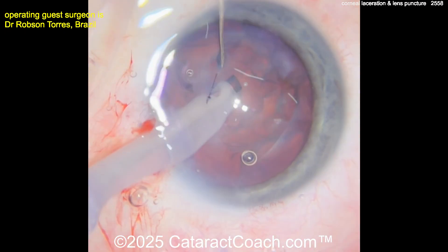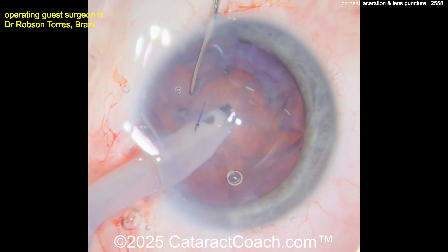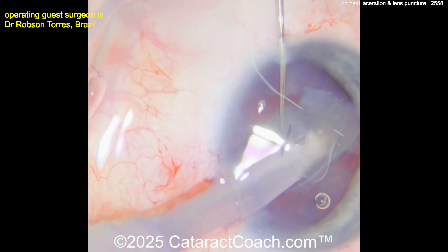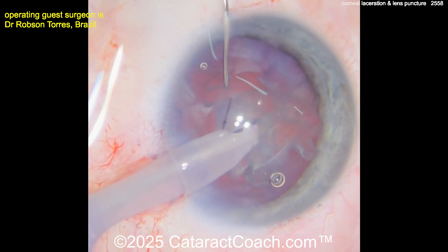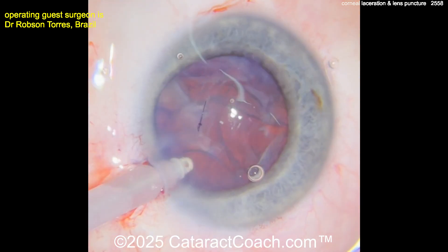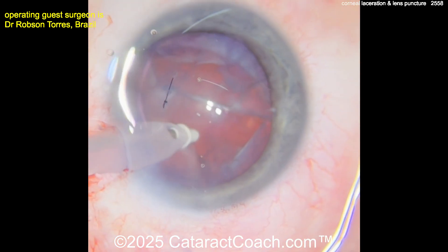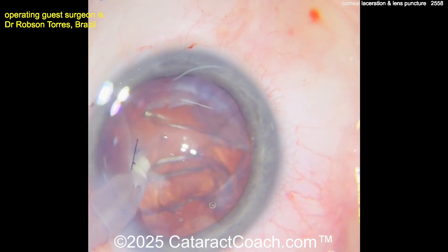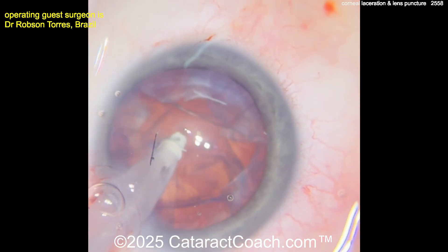Now putting the phaco probe in, you're going to aspirate this easily — again this is butter soft, you could just use the IA probe. You need to emphasize to this patient that they've got to wear safety glasses. When I do any work around my house I am so cautious about wearing them — we've seen all these cases in our own clinics. With the IA probe going inside the eye, remove all the cortex from the strong areas first, then go near the weak area towards the end.